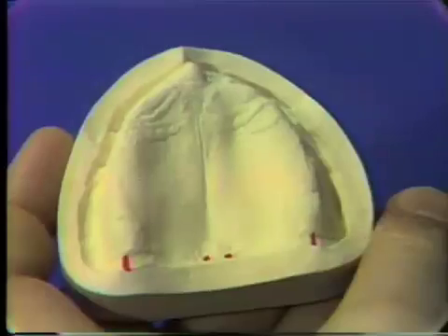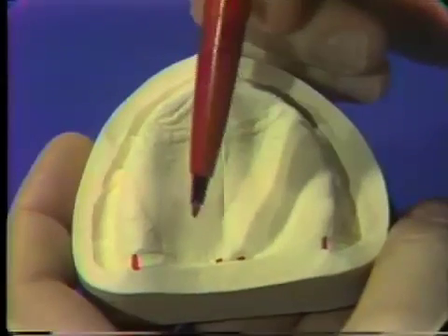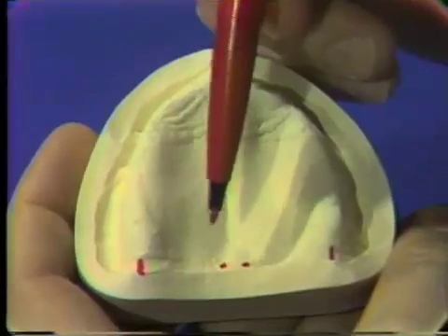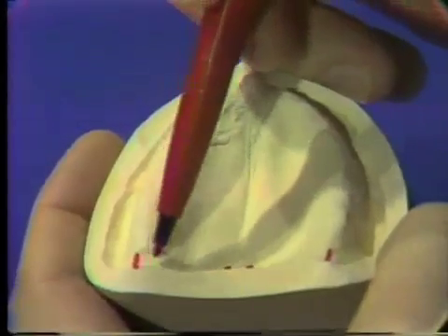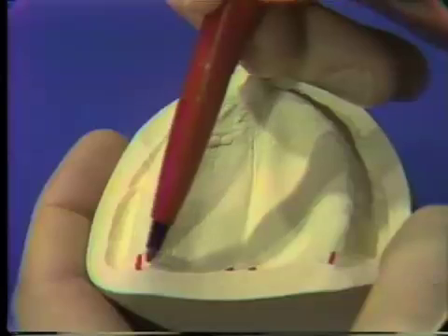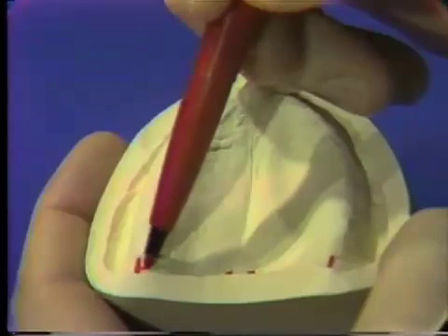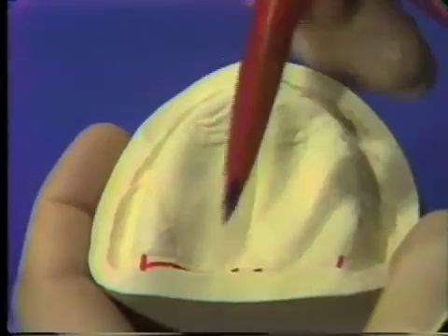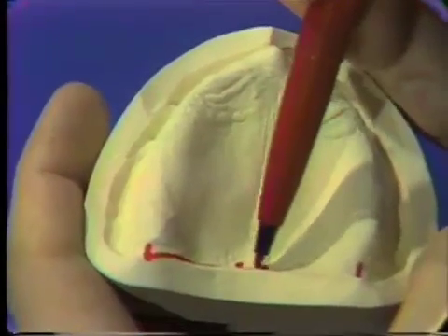In this particular example, that ah line is located about one millimeter posterior to the fovea palatine in the midline and extends to the hamular notch on either side. So I am going to draw the posterior border of where we want the denture and of course the post dam area to be.